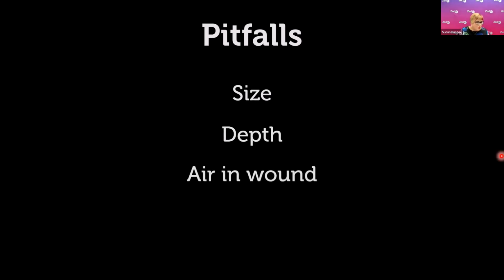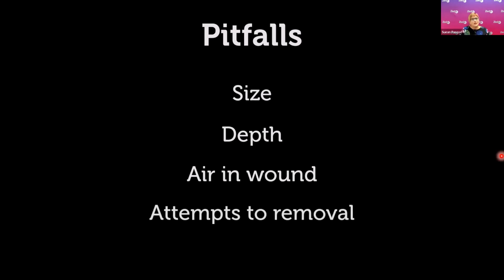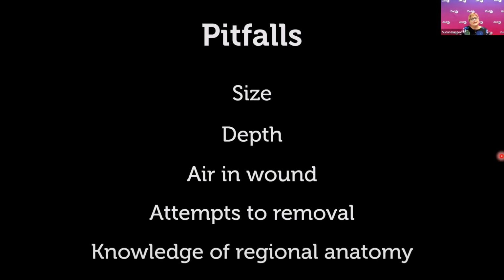If you have air in the wound, so if your patient has been trying to get the foreign body out and they've been digging around for a while, they can have air in the wound. And it can also macerate the tissue a little bit. And so it makes it a little bit irregular on the ultrasound and harder for us to see what's foreign body versus macerated tissue.